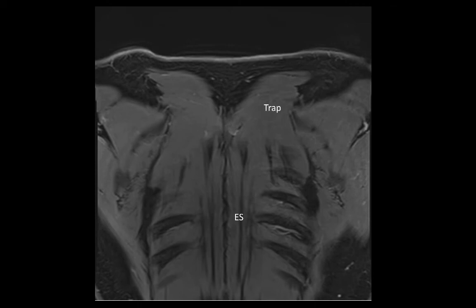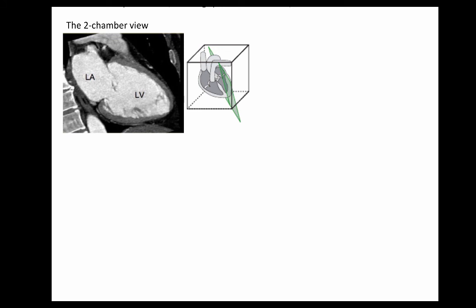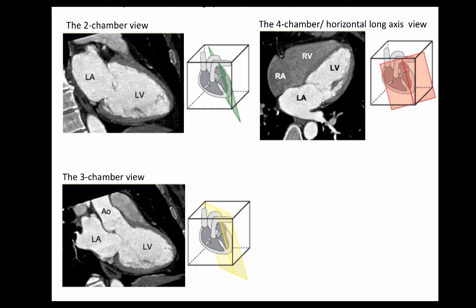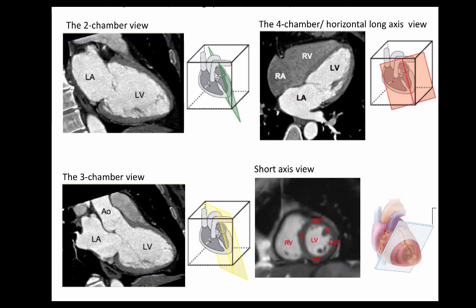One thing to note is that since MRI images can be viewed at any angle, there are some custom angles that we can use to examine the heart. Some examples are: the two chamber view in which we can see the left ventricle and the left atrium; the three chamber view in which we can see the left atrium, left ventricle, and the aorta; the four chamber view, also known as the horizontal long axis view, in which we can see all of the atria and all of the ventricles; and finally the short axis view in which we can see the left and right ventricles.